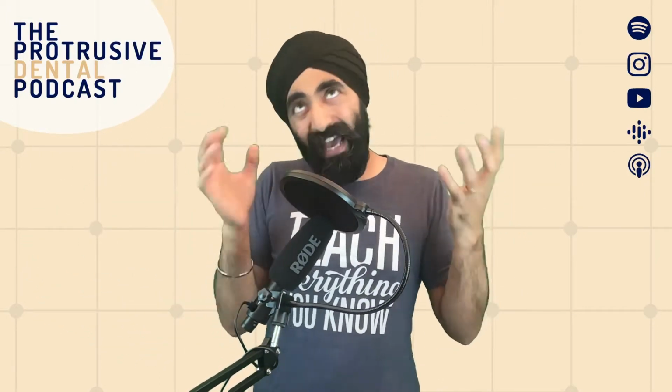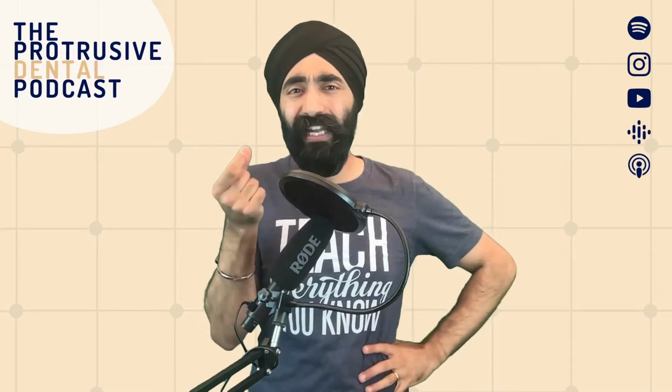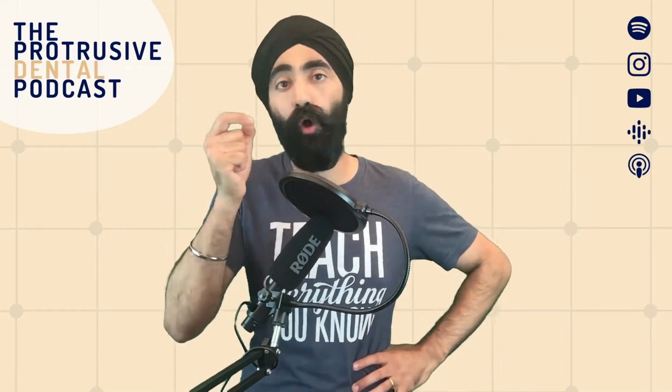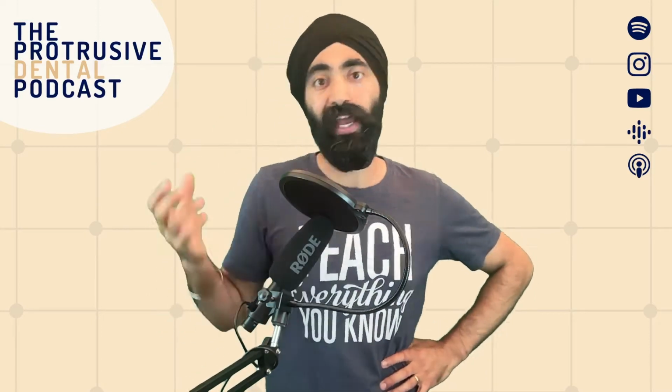Now, hopefully there's enough occlusal stability that the adjacent teeth will not tilt into the area, but we really miss out on a big benefit of having nice tight contacts on our temporary crowns, because temporary crowns, well, they're temporary. Okay, and they can come away.